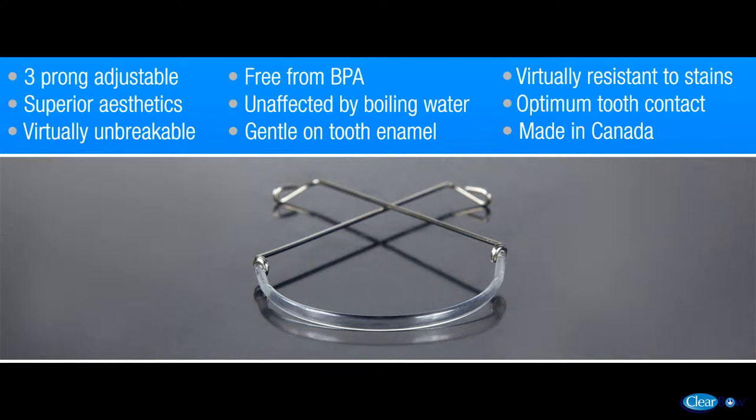The clear bow is the only aesthetic labial bow that can be adjusted with pliers for minor tooth movement without fear of breakage. This video will demonstrate a clear bow that is adjusted with three-pronged pliers to simulate tooth movement on a dental cast.